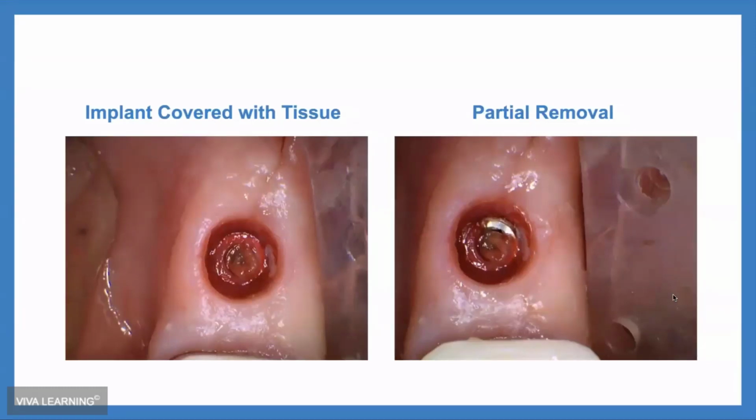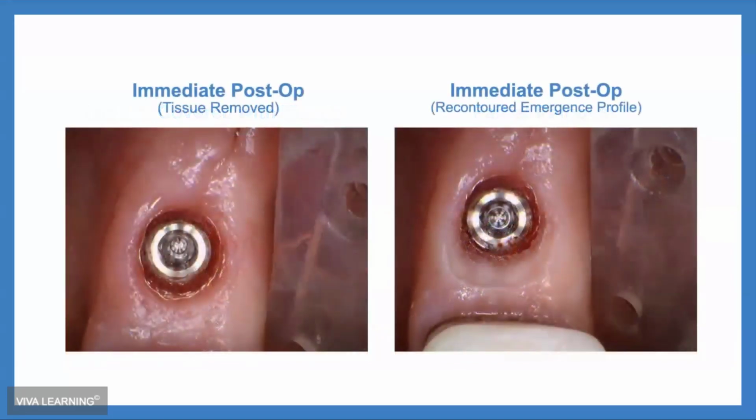But here you go. You have this and you're trying to help the patient. You're probably trying to reuse the implant crown or abutment that loosened up. As you can see, you set your settings on your laser and you selectively remove just the soft tissue from inside the implant and anything that's around it.